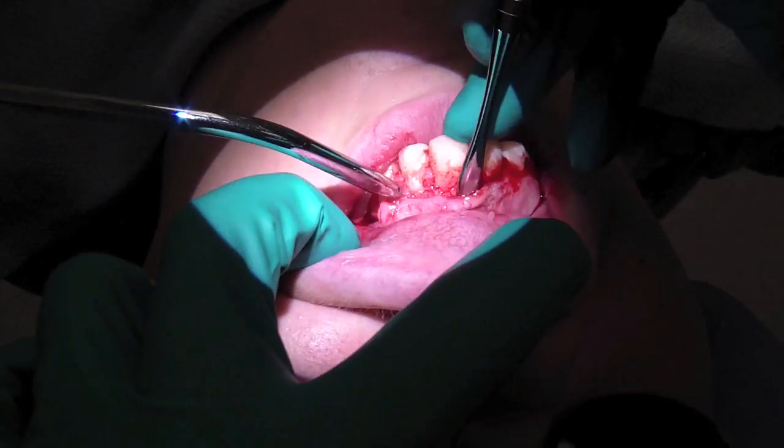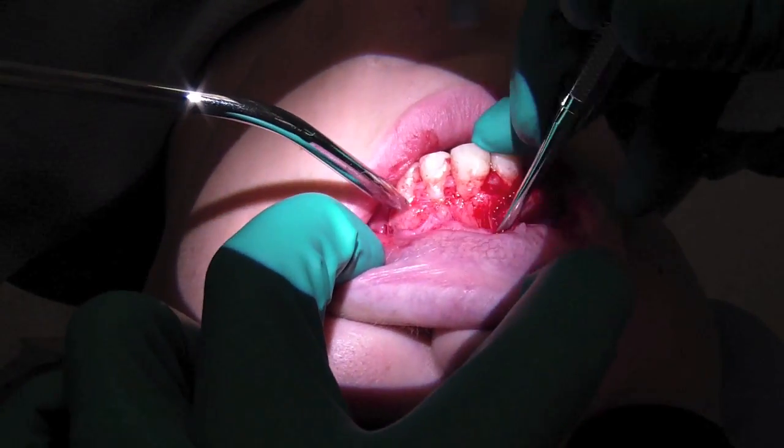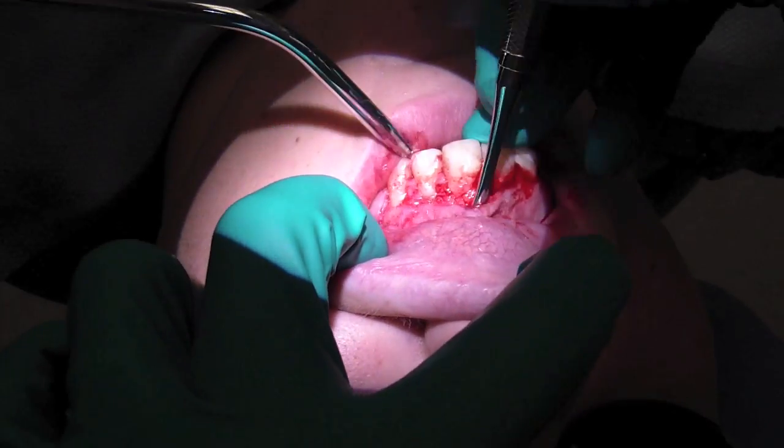She's got a thin biotype, and furthermore, when I'm placing my retractor, make sure there's no tension.